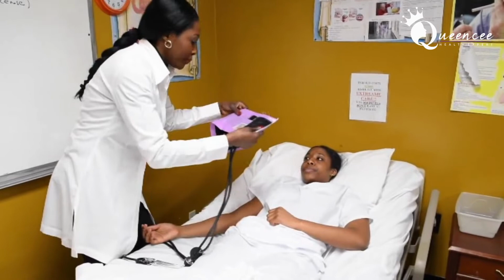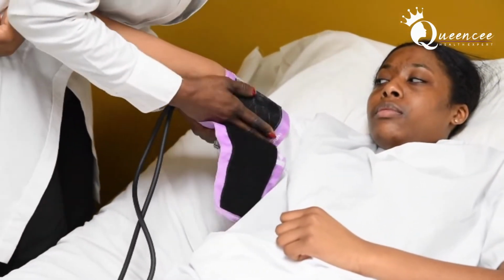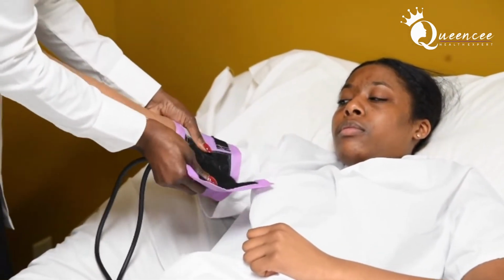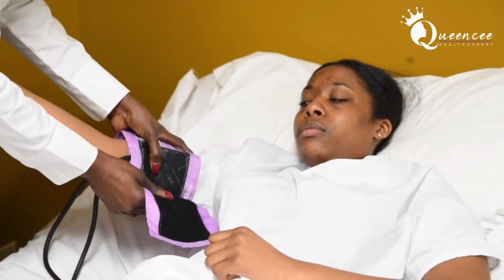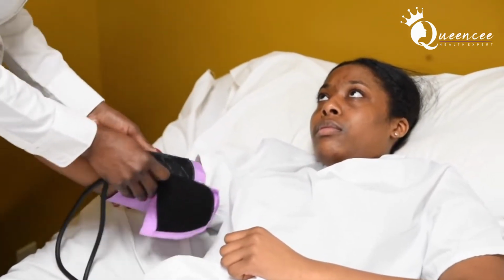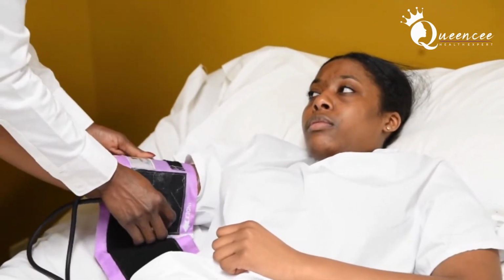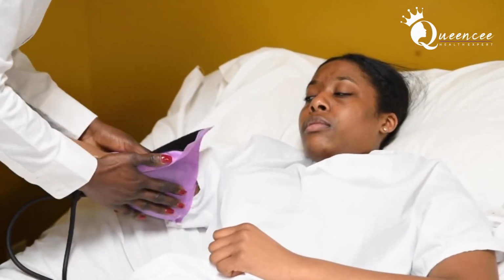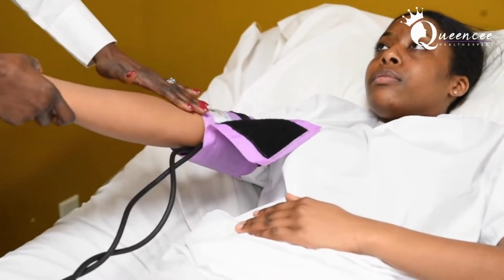Take my cuff and wrap it snugly. Remember that word, right? So this is what I'm doing, snugly. Sometimes when I'm testing students and they wrap the cuff and it's a tiny bit loose, they get all bent out of shape, trying to take it off and wrap it again. Just do this, and the more you practice, the better you become, like I just said. All right, just like that, and it's facing you.